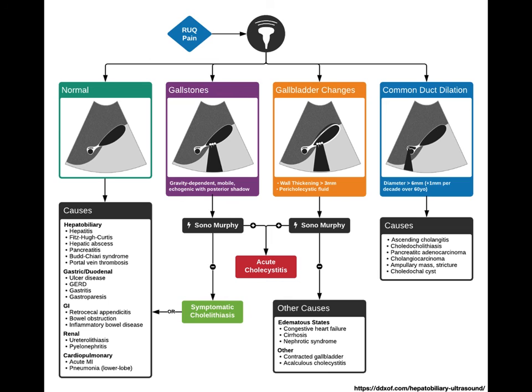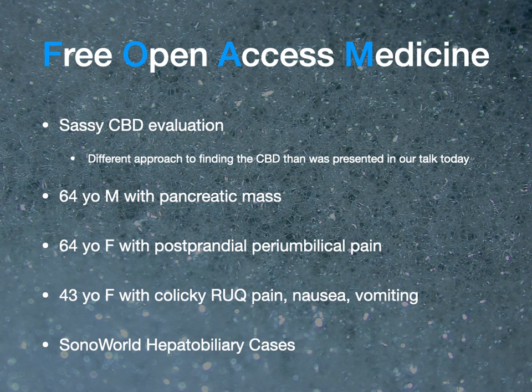In preparing for this talk, I found this really nice schematic to help conceptualize an approach to biliary ultrasound, which you can use to review. But I also wanted to give you a few great FOAM links for you to get more practice and case exposure. Additionally, I've got a few little Quizlet type of slides at the end of this talk, and I will send you the PDF version so that all of these links will be live.